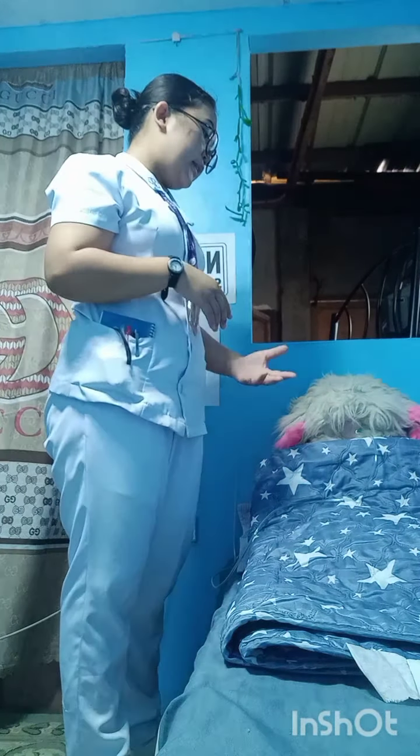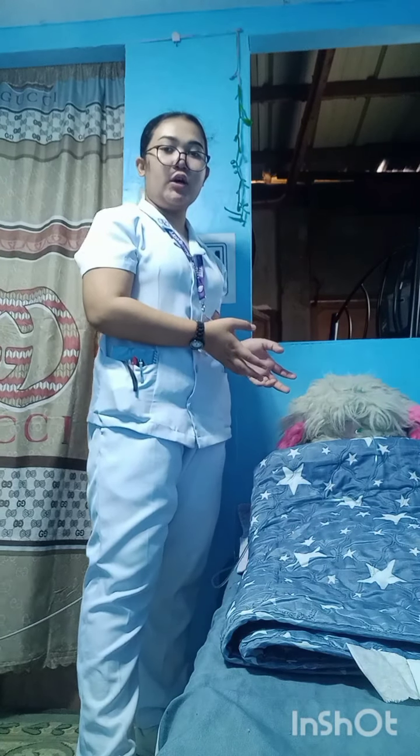Then, after that, we're done with the application of our cannula. We're going to move to the assessment of our client.